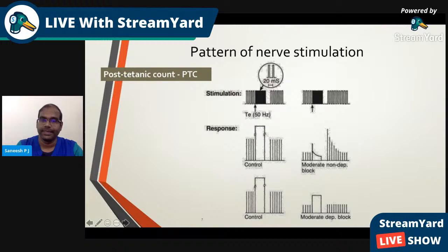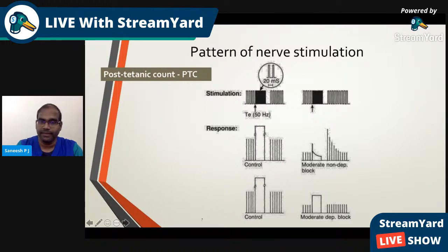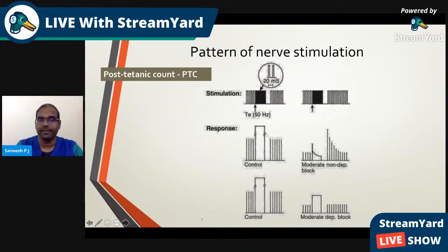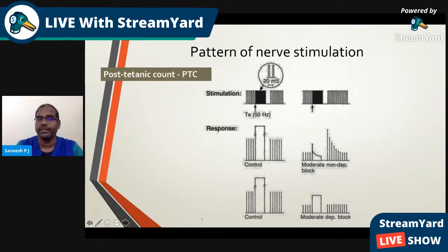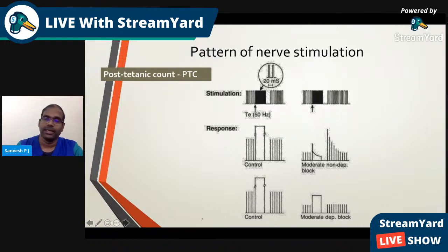The PTC pattern: here is the tetanic stimulus at 50 hertz, with each stimulus separated by 20 milliseconds. You can see an elevated response amplitude followed by twitches in response to single twitch stimulation after the tetanic stimulus. After administering a non-depolarizing relaxant, the tetanic stimulus produces fade in the response; the subsequent single twitches show an elevated amplitude with moderate non-depolarizing block, again showing a fading trend.